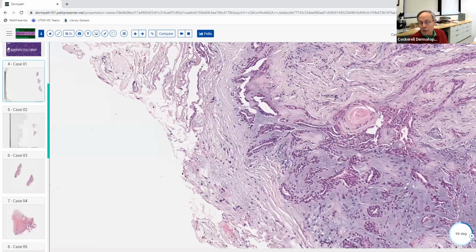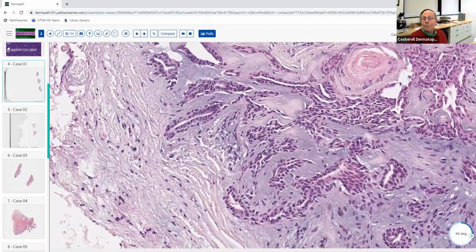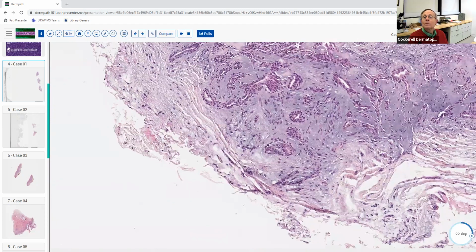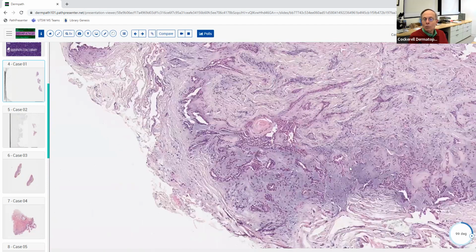That makes sense because if you're dealing with the eccrine sweat gland, those cells need glycogen to have their ATP-dependent secretory mechanism to pull out the ions and whatever. So that's why those cells have a clear morphology. So it's a ductal neoplasm. It's most likely eccrine. And then what you said about the stroma was helpful.